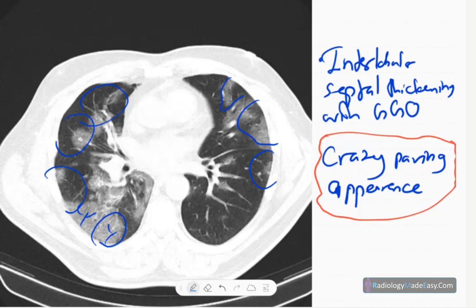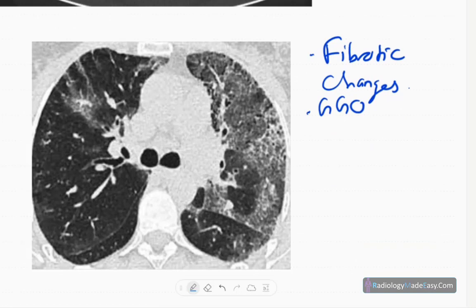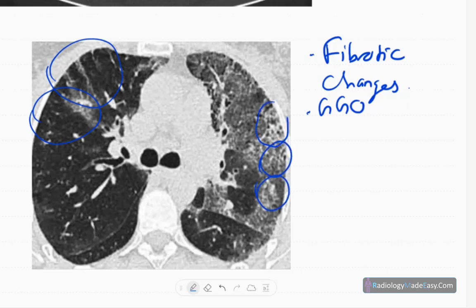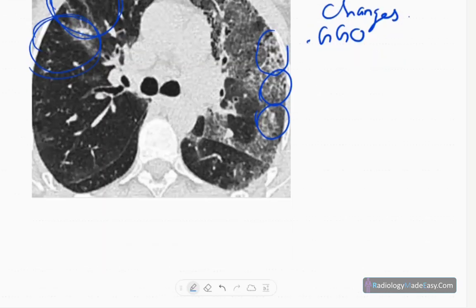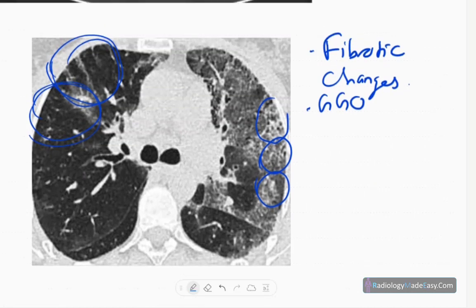There are no pleural effusions. Ultimately, if there is no resolution, the patient can develop fibrotic changes — including atelectatic bands and interlobular septal thickenings that are not reversible. These are the fibrotic changes seen at the late stages when the pneumonia fails to resolve.